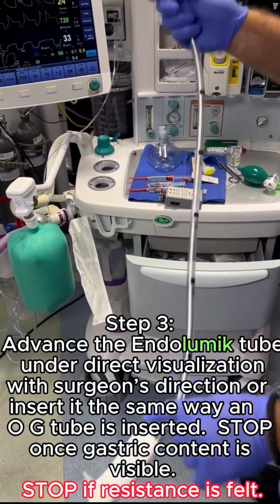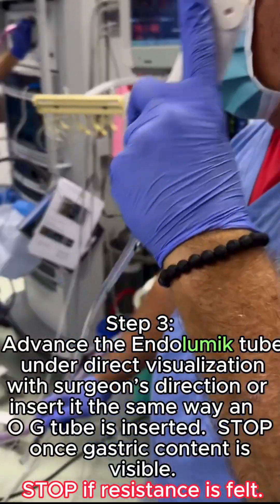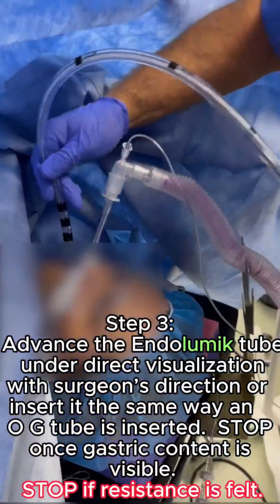Advance the endolumic tube under direct visualization with the surgeon's direction, or insert it the same way an OG tube is inserted. Stop once gastric content is visible.